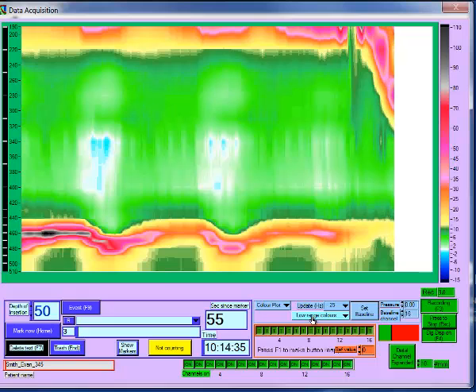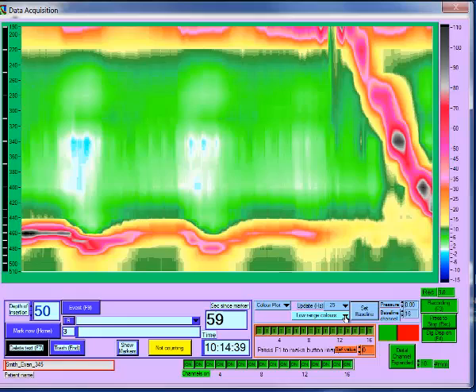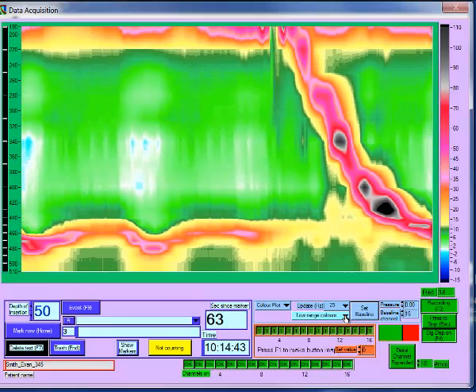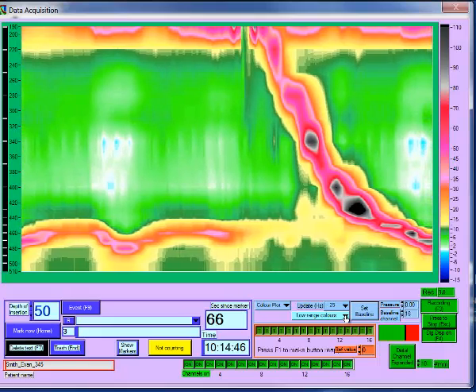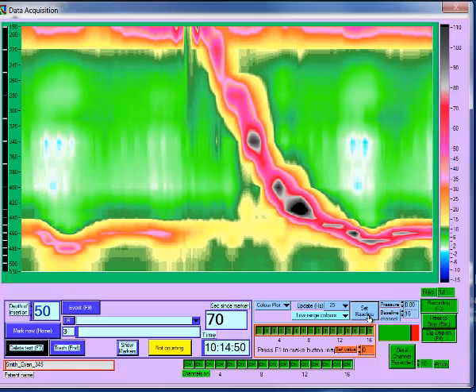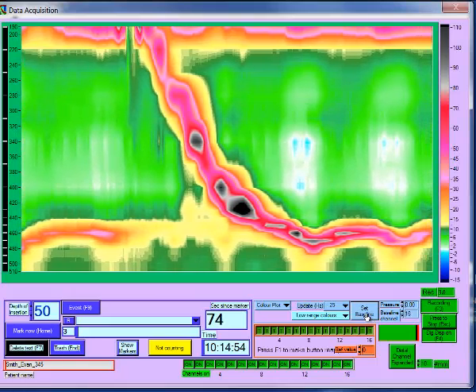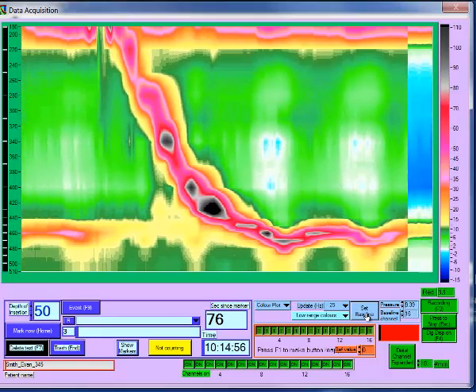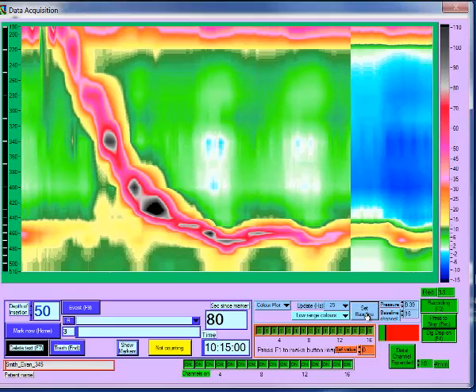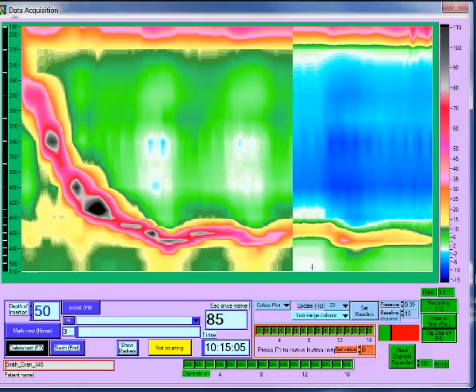Showing the color plot also brings up a number of other options. You can select the color scheme to be used, and you can set the internal gastric baseline to which the pressures will be referenced. The gastric baseline is set by clicking on the Set Baseline button, which will subtract the current intragastric pressure in the baseline channel from all pressures. You can see this by the change in colour at that point.